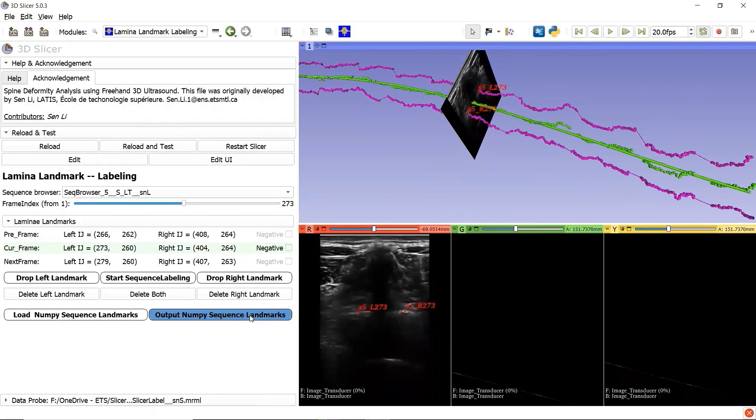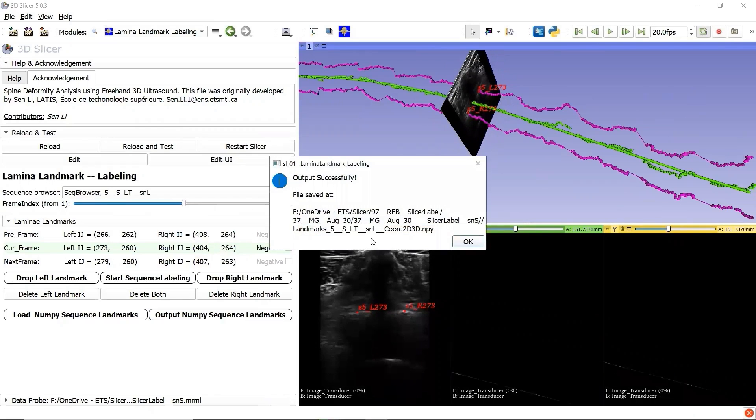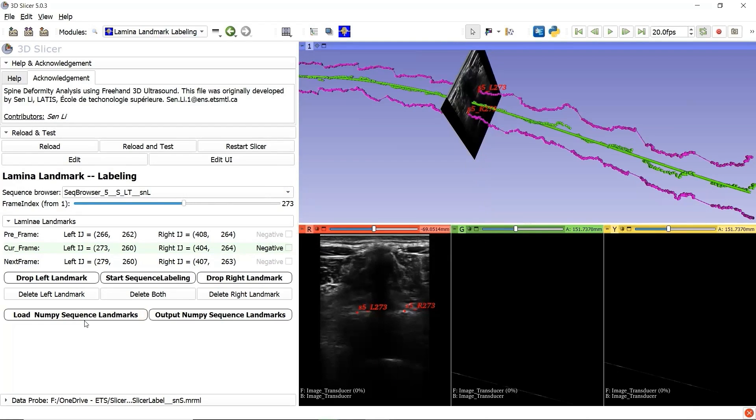If we click the button Output NumPy Sequence Landmarks, a NumPy landmark file will be saved into the sequence file folder. Then you can load the NumPy landmark file for this sequence by clicking the button Load NumPy Sequence Landmarks.